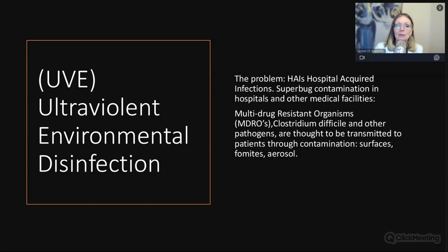Now, ultraviolet environmental disinfection, UV. The problem here that we know is that hospital-acquired infections, we have to be concerned about superbug contamination, and not just in hospitals, but also outpatient settings, medical practices, dental practices. Your patients don't walk in resistant to antibiotics. It's the bacteria that they come into contact with that is resistant, right?